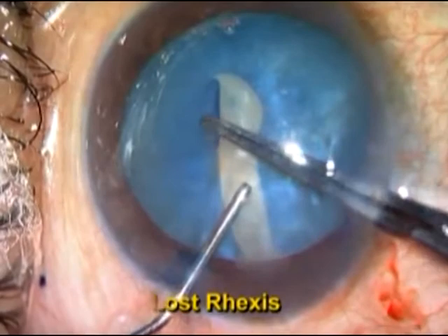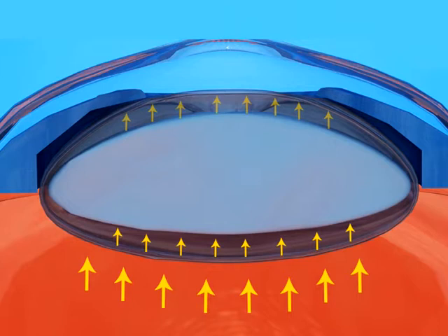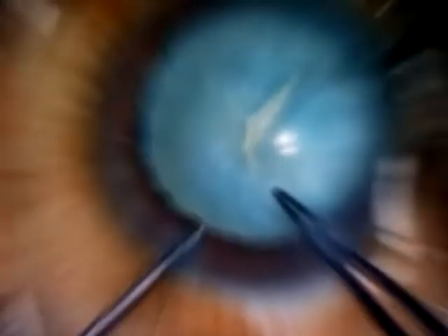White intumescent cataracts are a common problem in a country like India. The main problem associated with white intumescent cataracts is a very high intralenticular pressure which makes the rhexis very difficult. This animation shows the increased intralenticular pressure from both the anterior and posterior aspects of an intumescent cataract, which pushes the lens forward, increasing the chances of the rhexis escaping to the periphery.